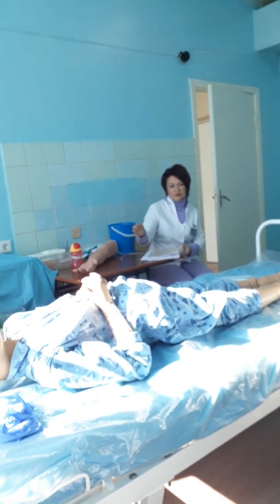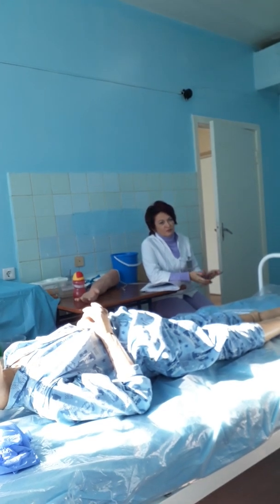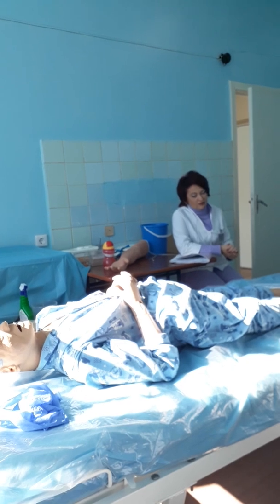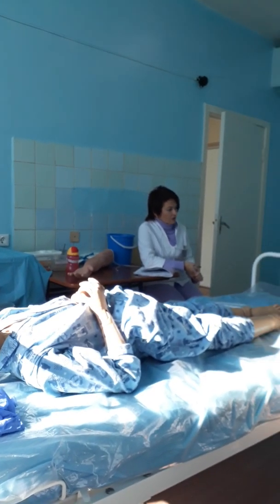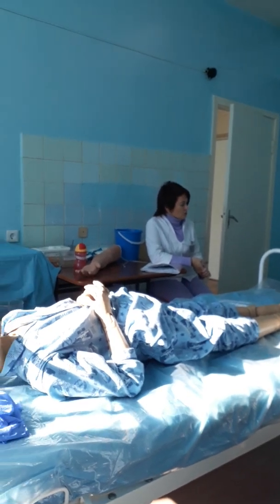But now we ask only about peripheral veins, and now I show you the main rules, like how you will administer your medicine intravenously using a syringe.